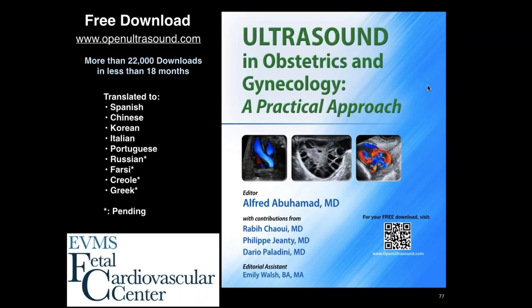What is the earliest gestational age where it's safe to use color or power Doppler to evaluate the fetal heart? There are documents available on the AIUM website, also on the ISUOG website, that talk about this. We try to avoid pulsed Doppler in the first trimester because of the increased focused energy on the fetus. Color Doppler in a short amount of time is safe and has been deemed to be safe, and you have to weigh the risk-benefit equation.